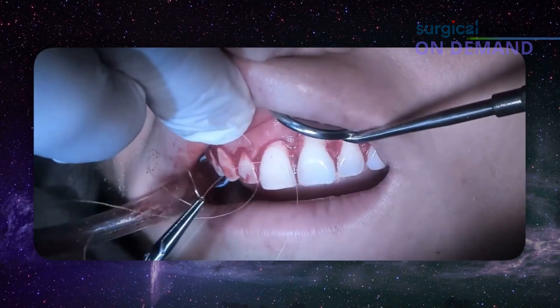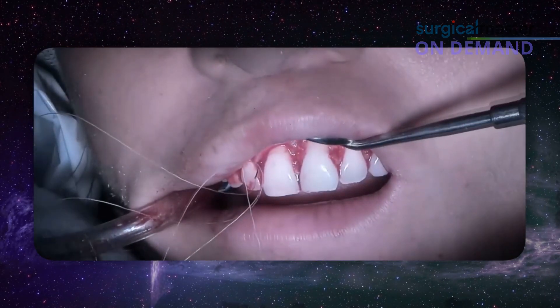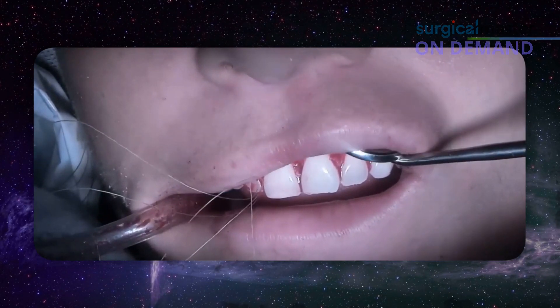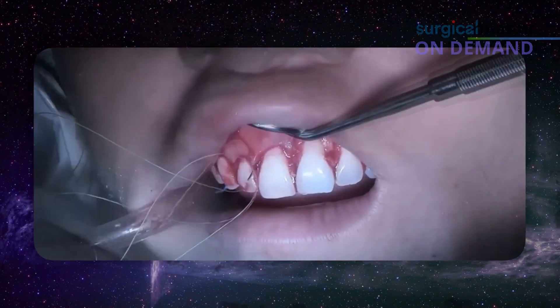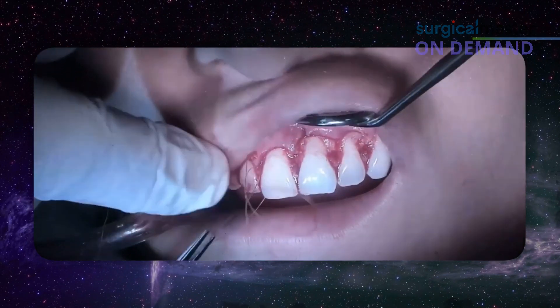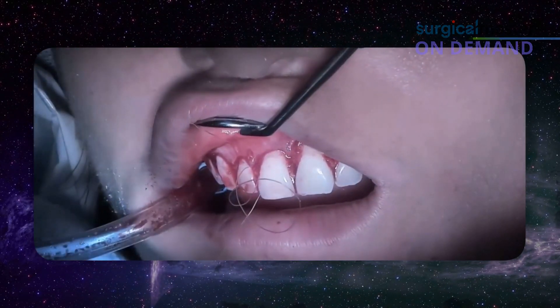Then we go into the interproximal. Then we ask the patient to open so I can get the edge of the needle. Simple interrupted. If you have a large papilla, you can use a vertical mattress.